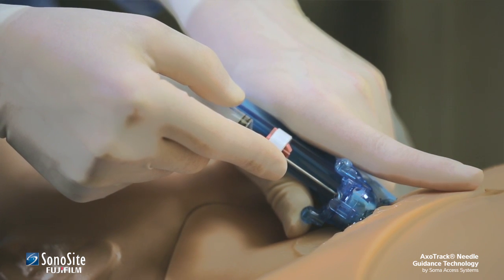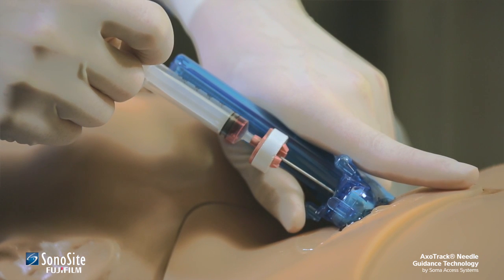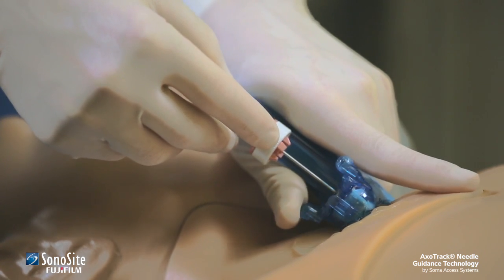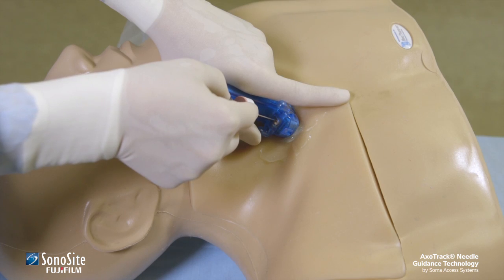Correct needle location must be confirmed by the appropriate clinical indicators, such as blood return in the syringe. When the needle is in the appropriate position, the practitioner can actuate the needle clamp with the thumb to hold the needle in place. Holding gentle pressure with the thumb facilitates guide wire feeding or aspiration.